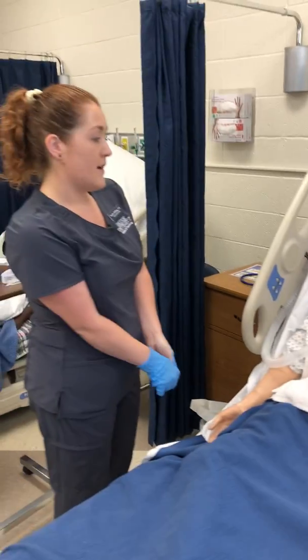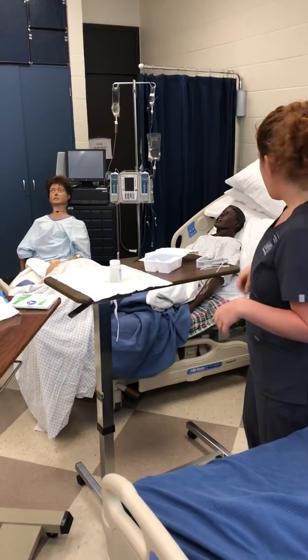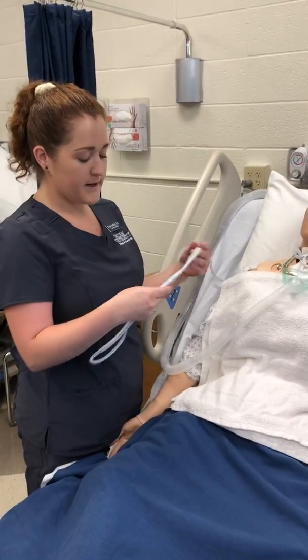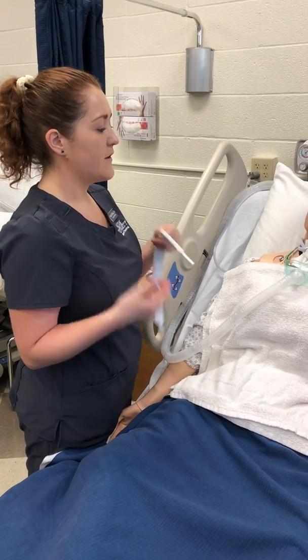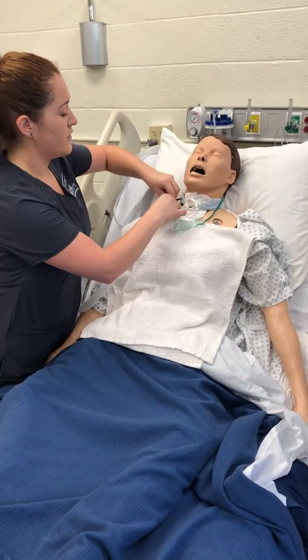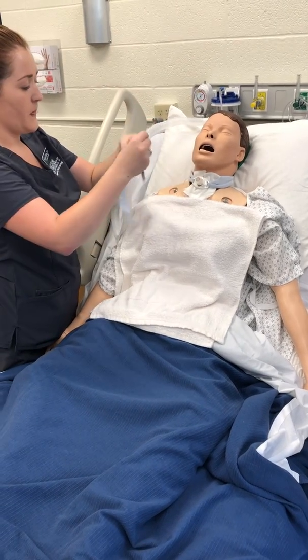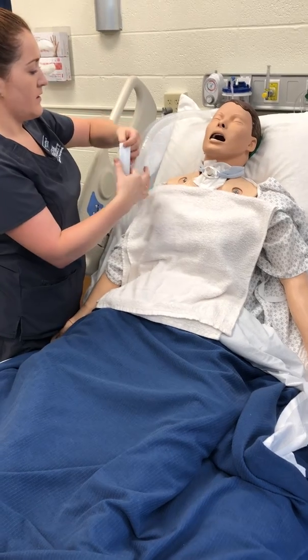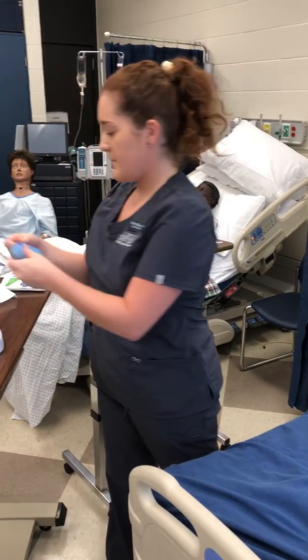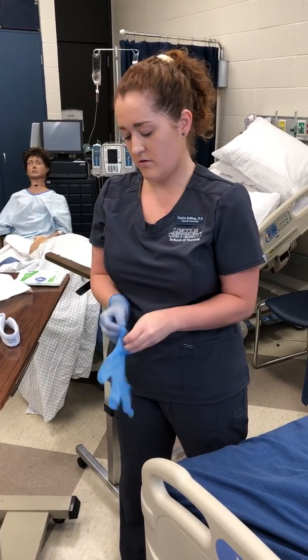Now that that is done, I'm going to remove my sterile gloves and perform hand hygiene. It is now time to change the trach collar as well. You don't have to do this every time, but any time you notice debris or sputum on it — or whatever your hospital policy is for how often you need to be changing it — just make sure you're following that. I'm going to put on some clean gloves because I need to hold his trach in place as I change the trach ties.